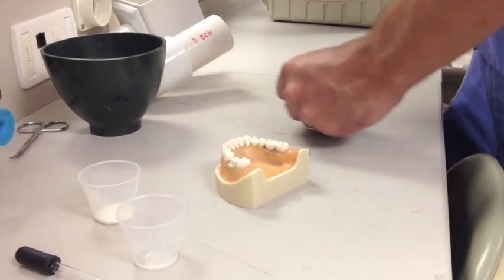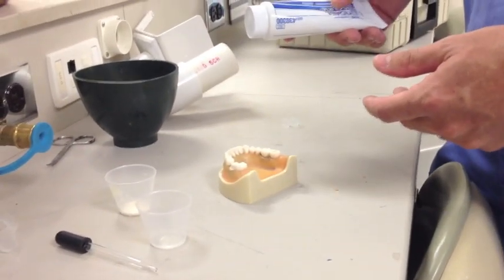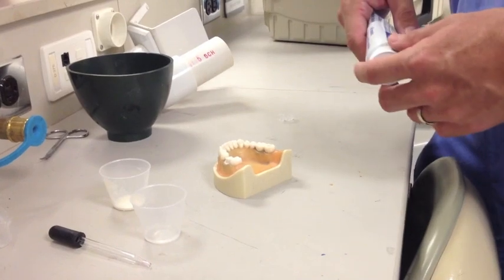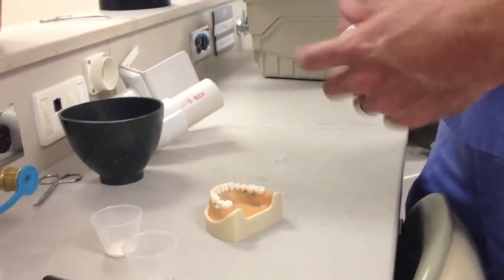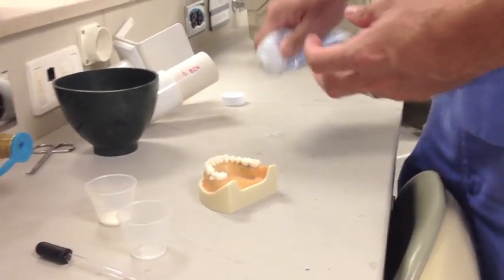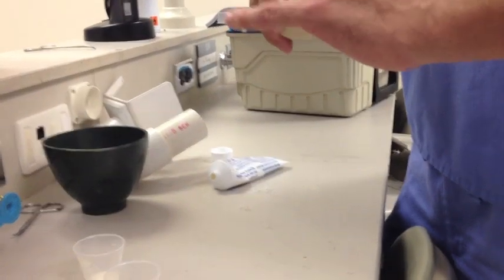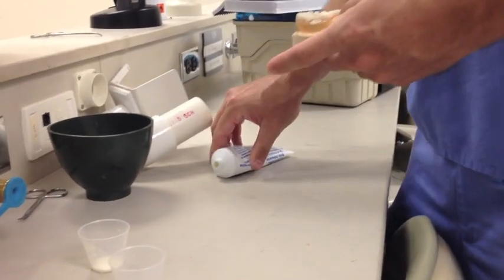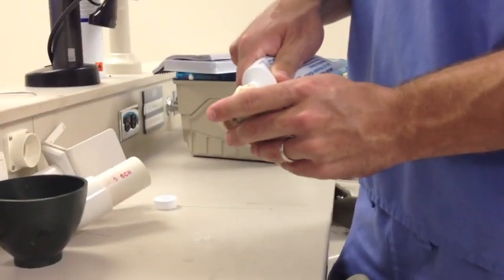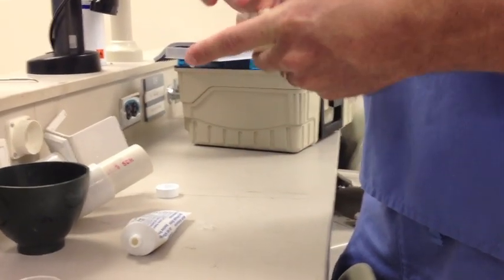We also have some Vaseline. You won't be using Vaseline in clinic on a real patient — it's actually so much easier to do in clinic because the saliva kind of keeps it from getting locked on. So we're just going to make sure we lube up the typodont here nice and good.